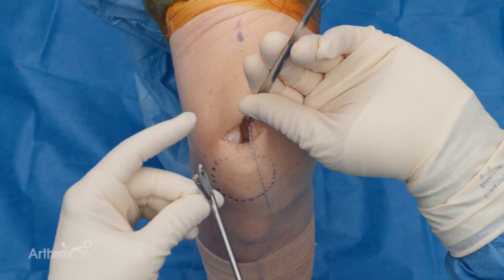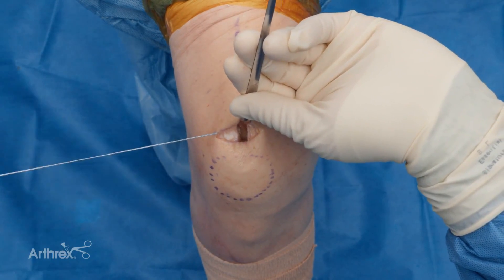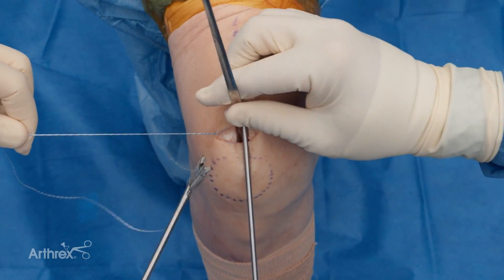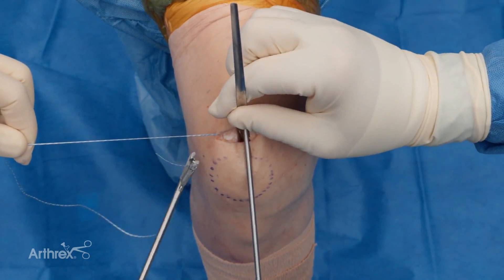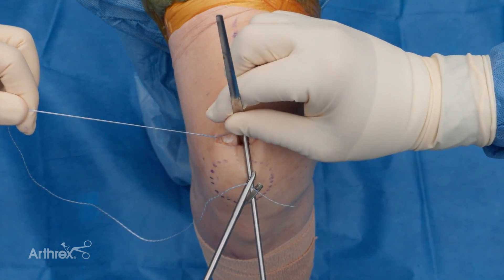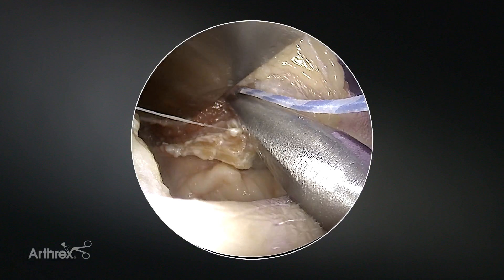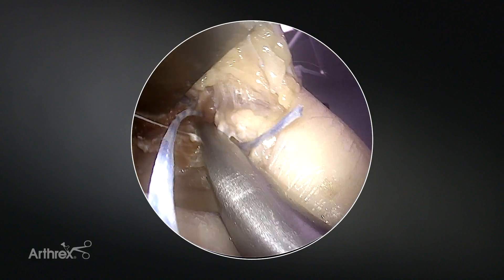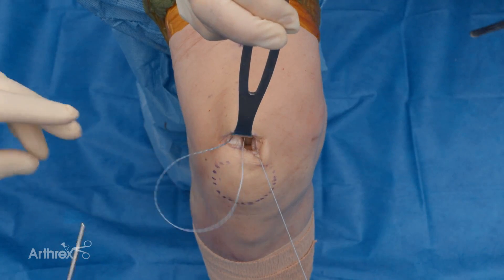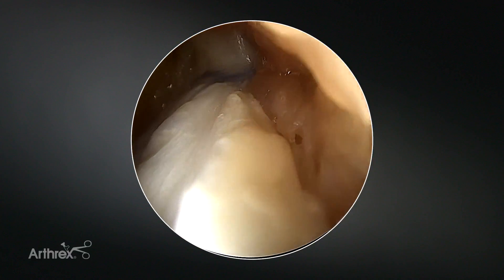We're going to go ahead and load the scorpion again, and now I'm going to bring my suture over to the left side. With the second pass, instead of going forehand, I'm going to turn the scorpion upside down so I can get an up-down orientation, just like you would do a normal closure. I'm taking the bite on the contralateral side, and notice I've changed the orientation of the scorpion. You can see as we pull that suture how the tendon comes together.